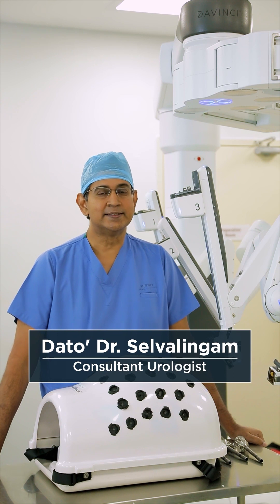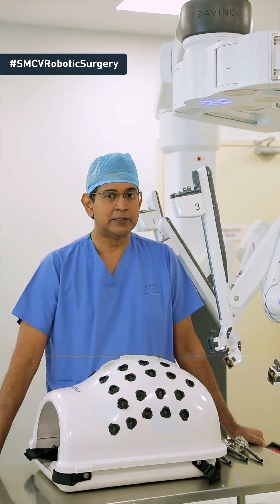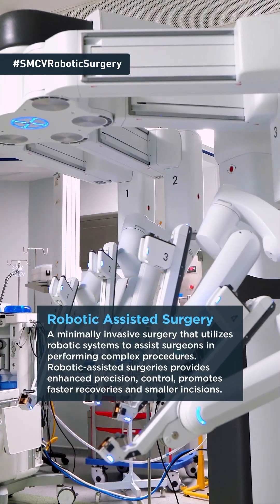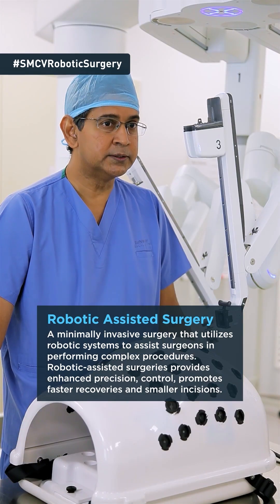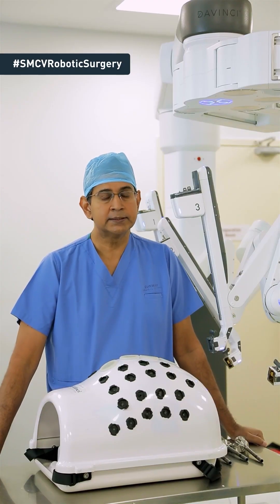Hi, I'm Dr. Selva. I'm the urologist at Sunway Medical Centre Velocity and I'm here to guide you and talk to you about robotic assisted surgery. Robotic assisted surgery has been around for quite a number of years and I think many of you have heard about it, but not many of you may have understood how this surgery is being conducted. So I would like to show you in a brief moment how we do the preparation for this surgery.